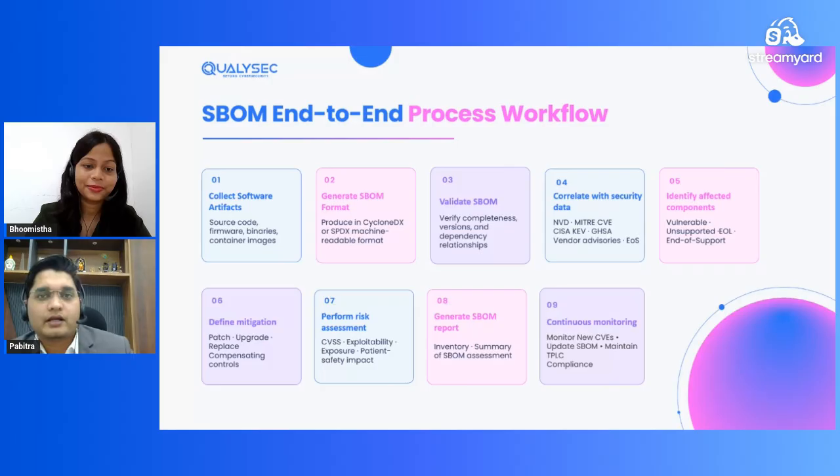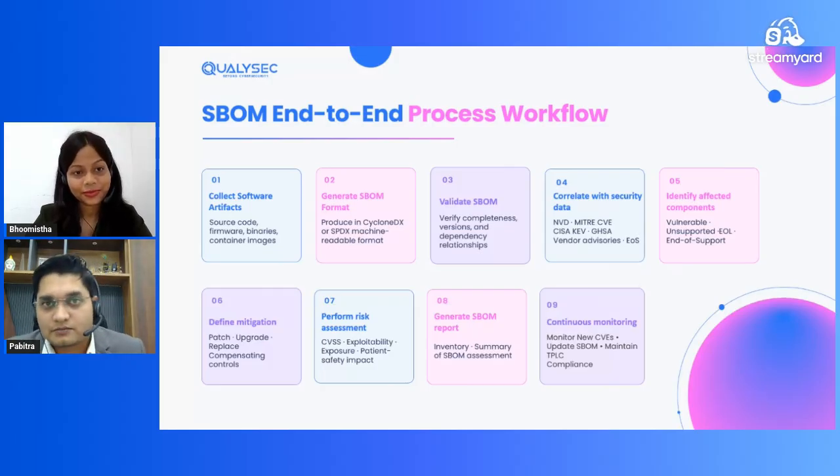Totally agreed. This SBOM is not just a report; it's a process. If you see it in a different way, not just as compliance with a certain regulation, this SBOM will benefit you throughout the development life cycle. That is where the value is generated.